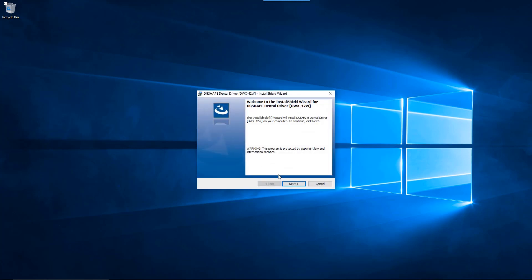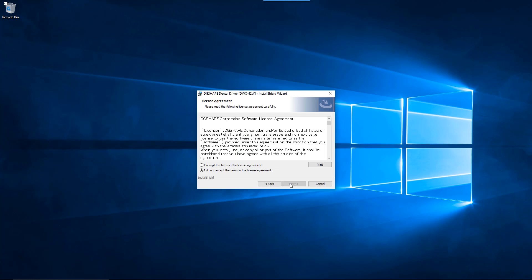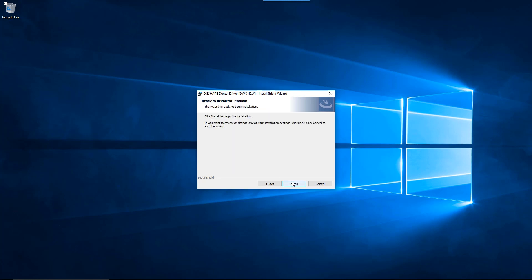When the InstallShield wizard is displayed, click the Next button to proceed. Review the Terms and Conditions. If you accept the Terms and Conditions, click on the I Accept button, then click the Next button to proceed. Click the Install button to start the installation process for the driver.